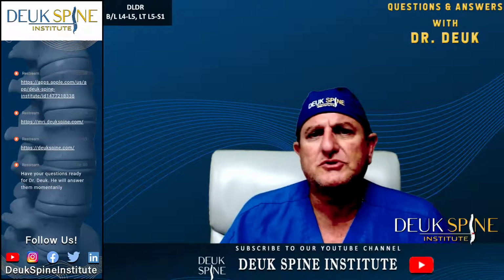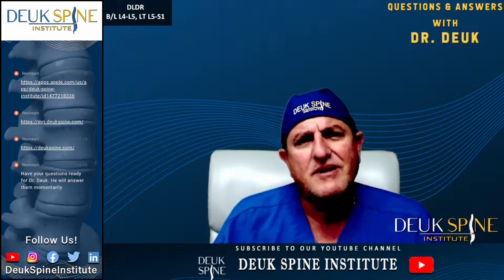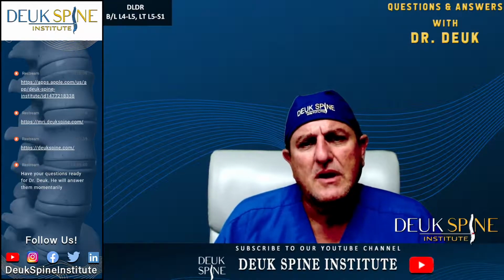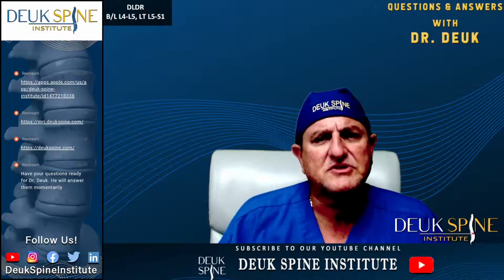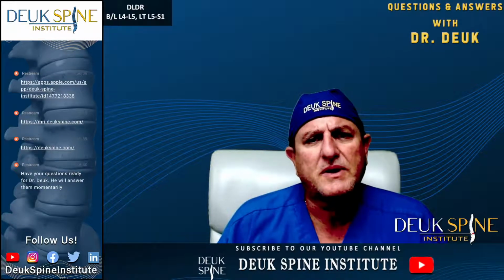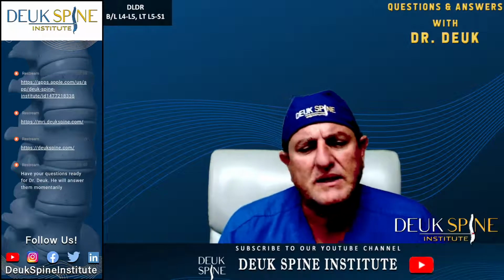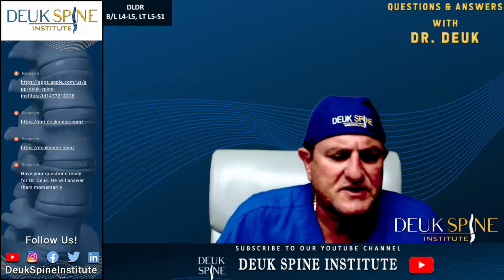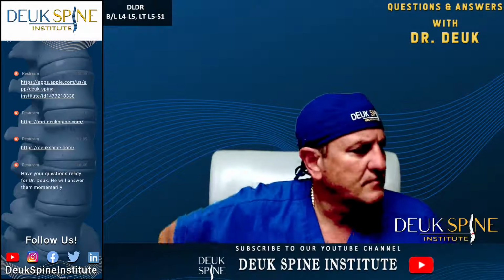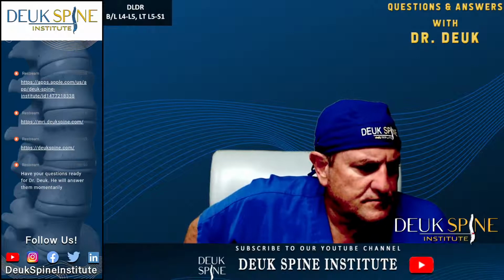So no, we don't do the Deuk laser disc repair on people with ankylosing spondylitis unless they're having pain from a herniation of a disc, and they have a typical problem like most everybody else. But ankylosing spondylitis itself is not something that anybody should be operating on unless you have a disc problem that's causing pain, or a fracture.